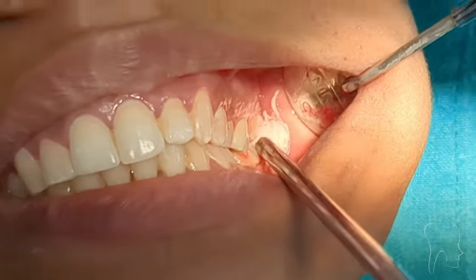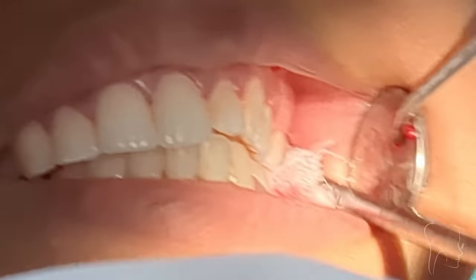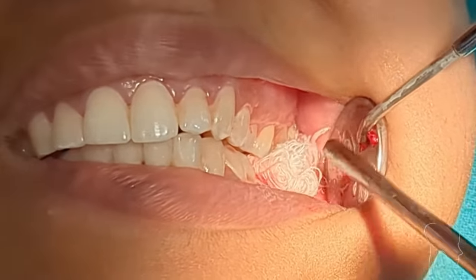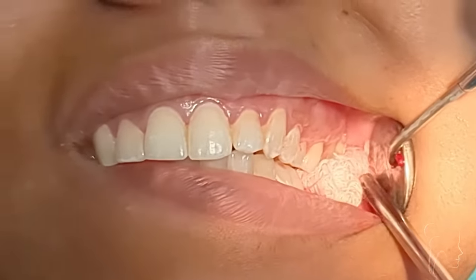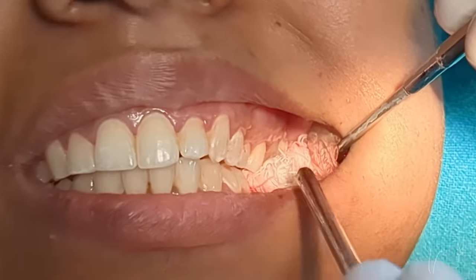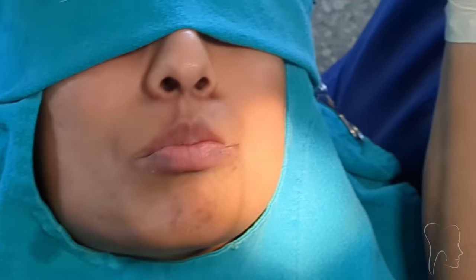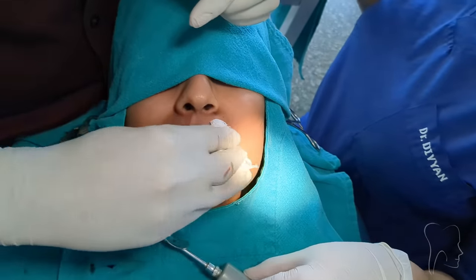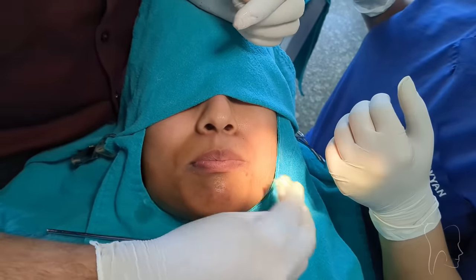The irrigation must be done under pressure. You can see the teeth are in occlusion and the gauze is applying pressure directly over the socket — this is how a pressure pack should be done. Both pressure packs are placed over the extraction sockets without interfering with the occlusion, so all teeth are in proper occlusion and the packs are sitting directly over the sockets. Finally, make sure there are no blood spots on the patient's face — clean the patient's face before they leave your clinic.